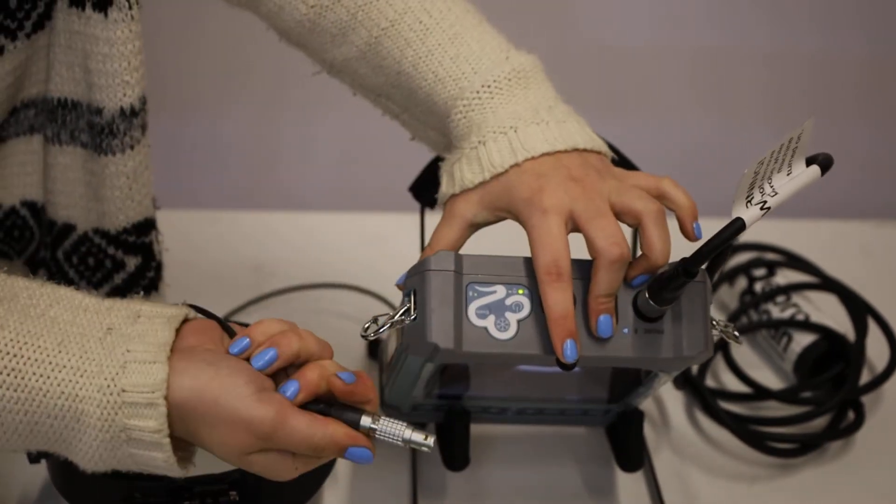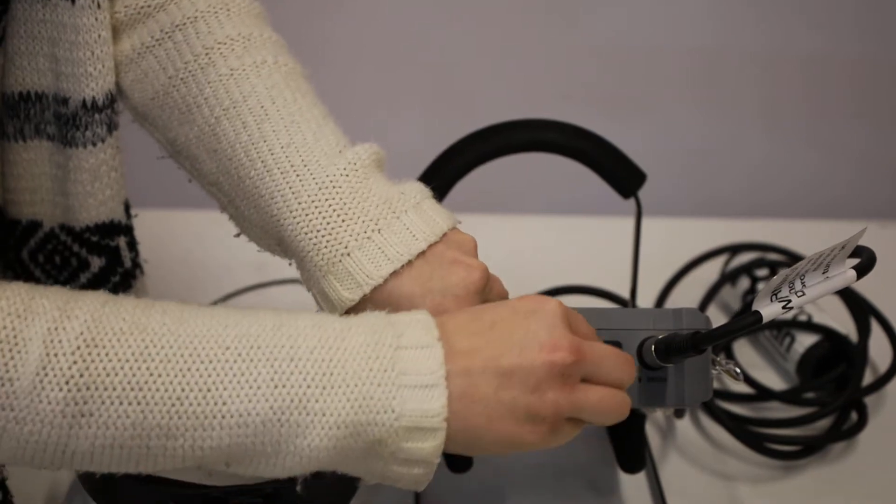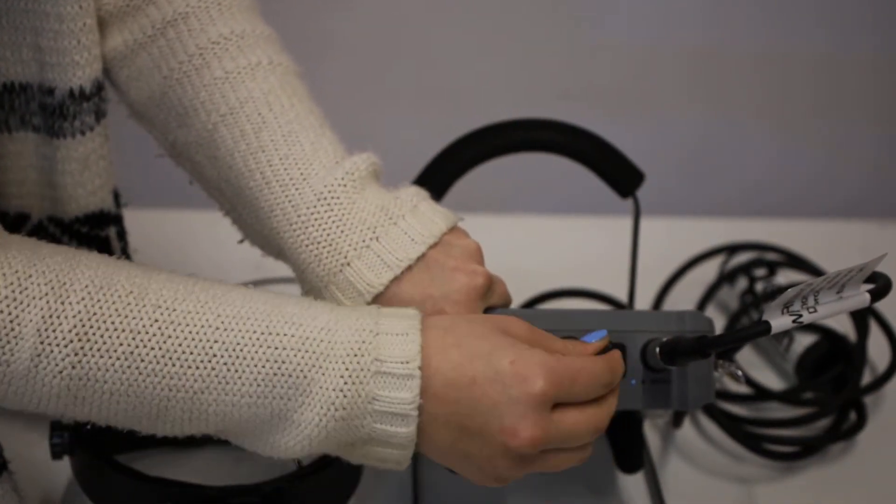You go red dot to red line and connect. Push all the way down so that you hear that click. Make sure it's secure.